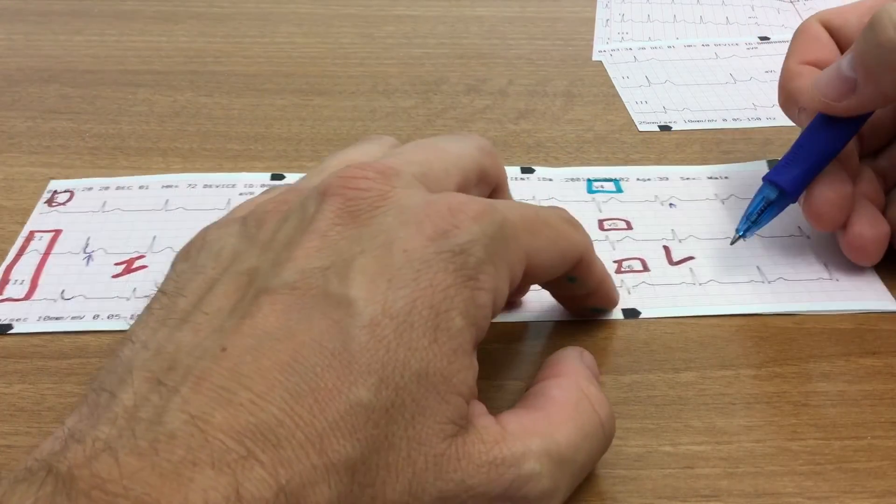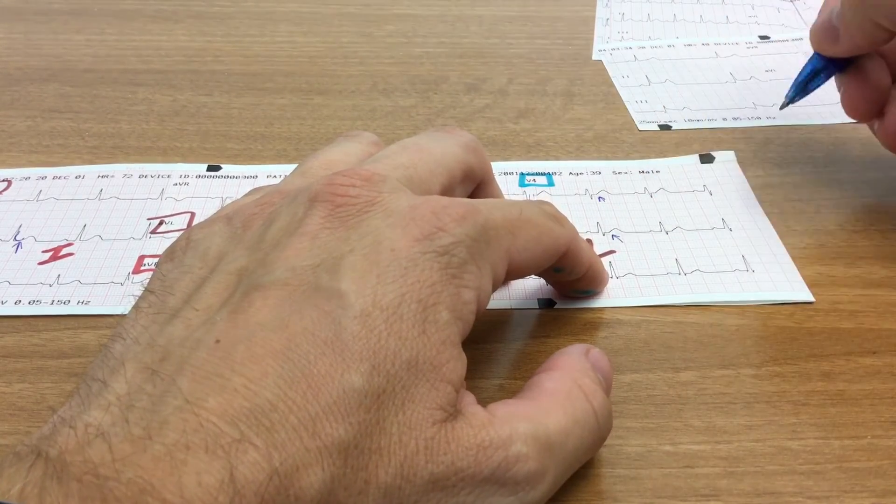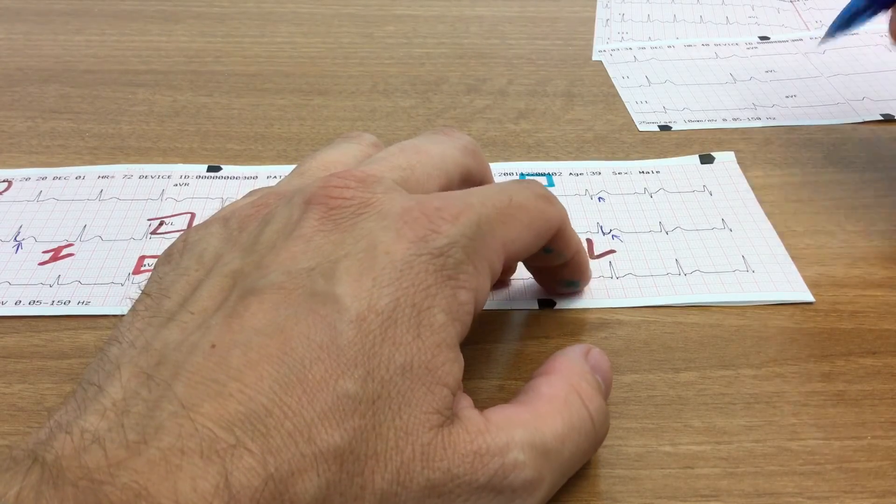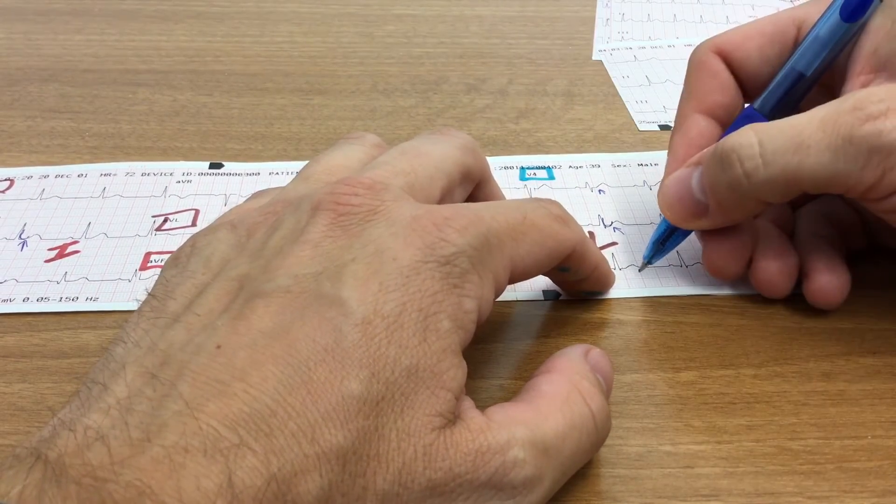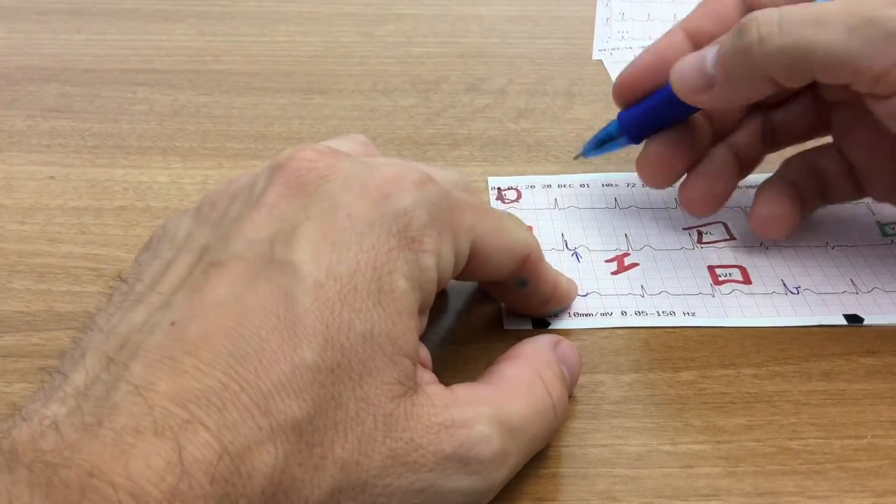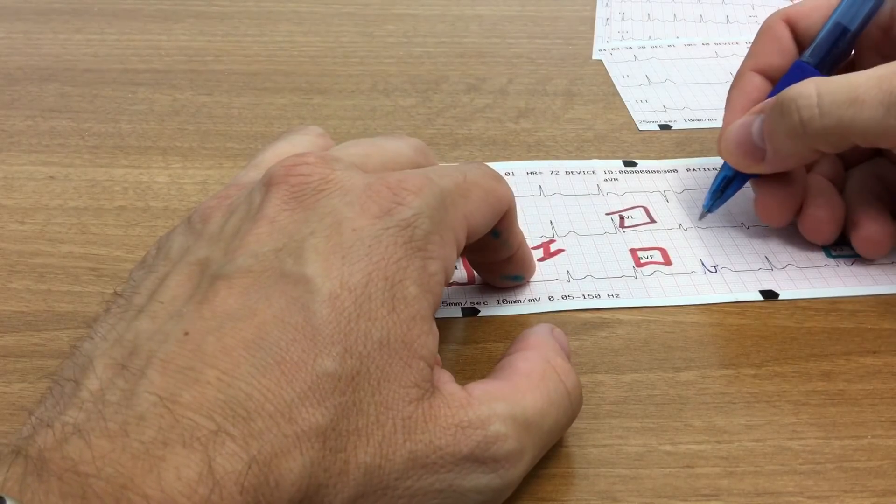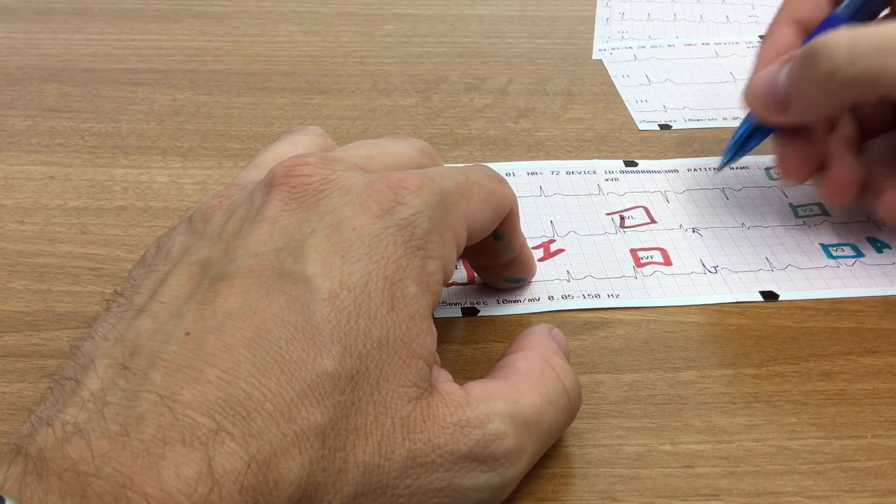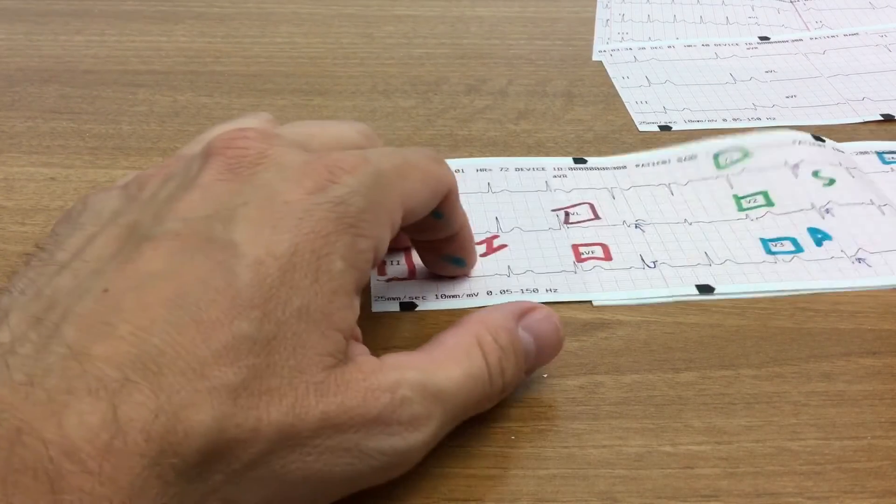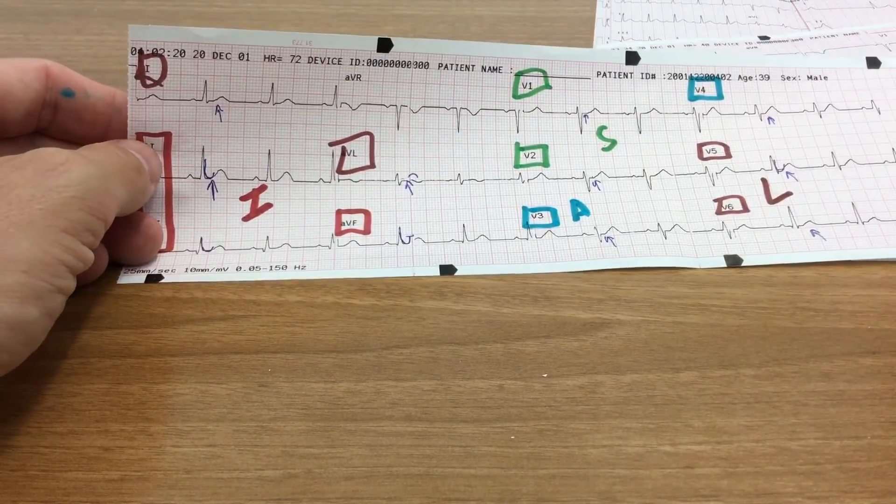And then finally, we'll move on to the lateral wall. Okay, so V5. Again, you can see that I have my J point. Good return to baseline there. Okay, so the ST segment checks out there. V6, the same thing. Moving on to 1, the same thing there. And then AVL. Again, you have a baseline and then your T wave. And so the J point checks out there as well.